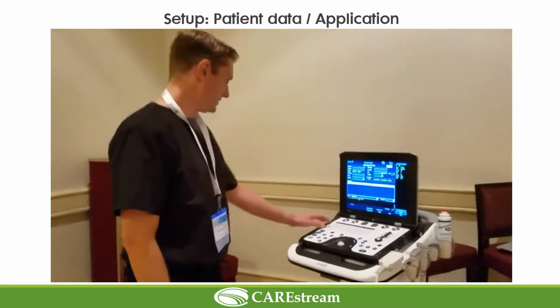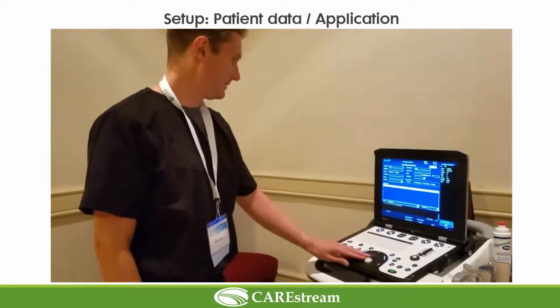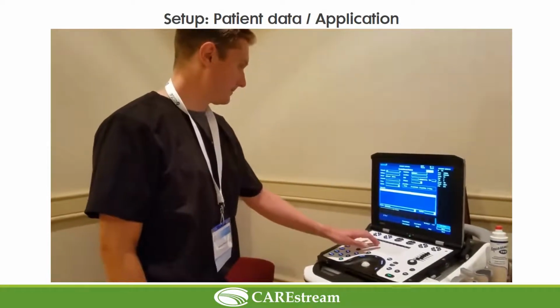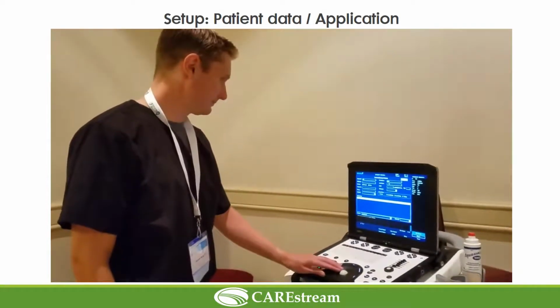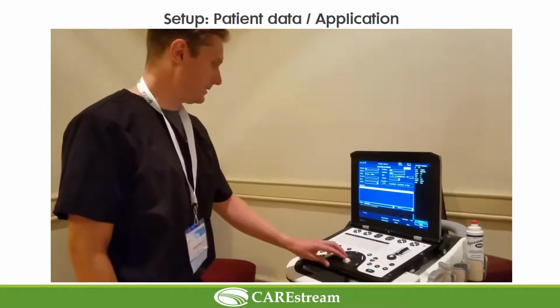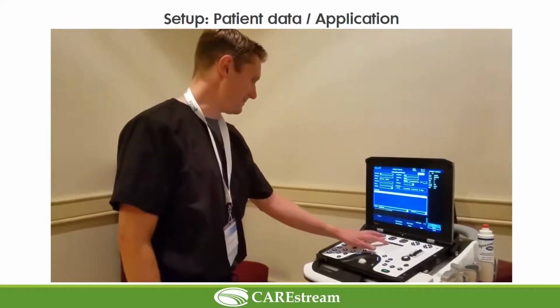We put in our patient ID, name, last name. And for Medicare, you do need a date of birth. Okay. And people ask that every day.